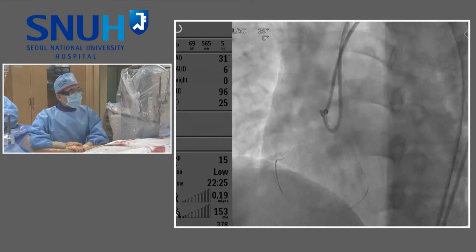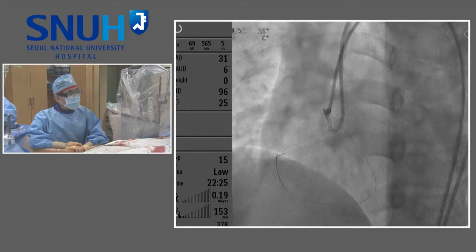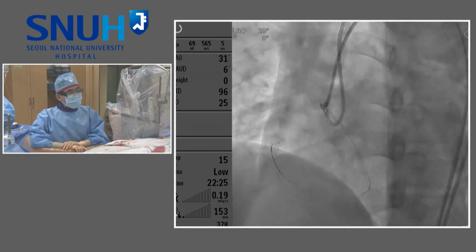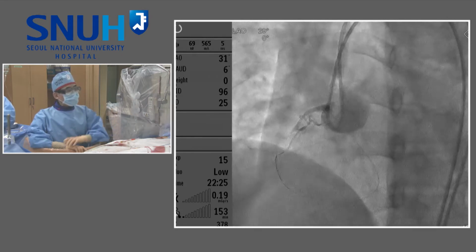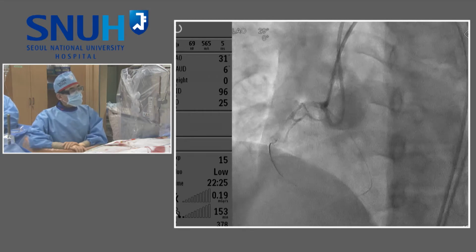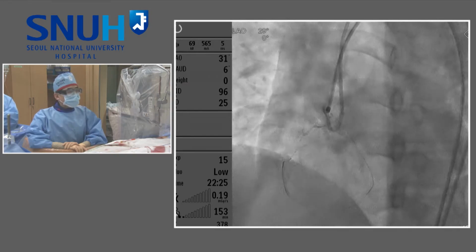Then I check the antegrade angio to localize the proximal and distal stump. Here is the tricky point of the distal stump. Dr. Asakura suggests the wire tip is a kind of side branch of the distal stump, so the actual distal end of the catheter is the true distal stump. That is a very tricky point in this case. Do you have CT data? Yeah, on the slide I showed the CT data. Okay, once again slide, CT slide.